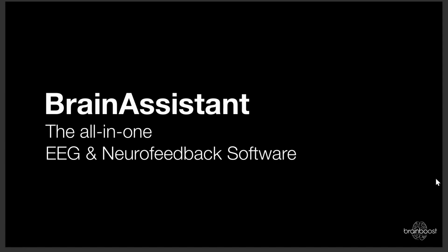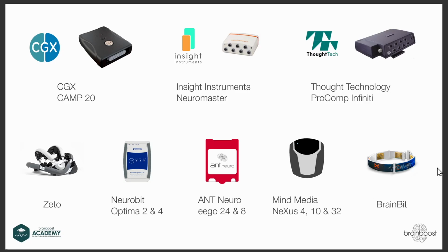As always, our Brain Assistant connects with many different manufacturers. If you have hardware lying around and you're kind of sad that it doesn't connect with the Brain Assistant, please feel free to contact us and contact the manufacturer, and we're always happy to implement new hardware.